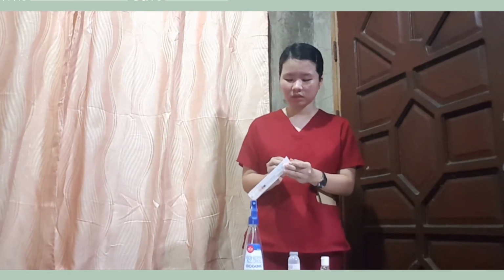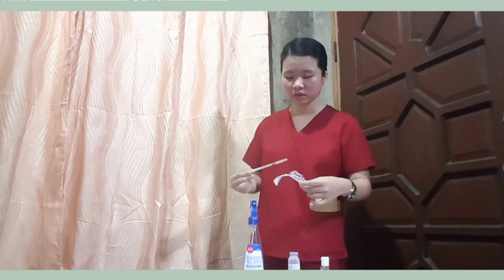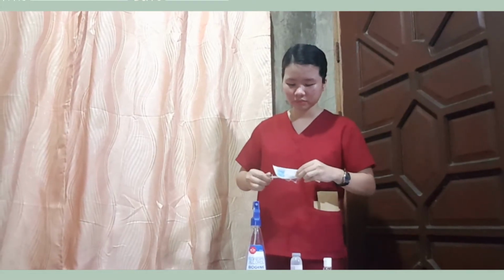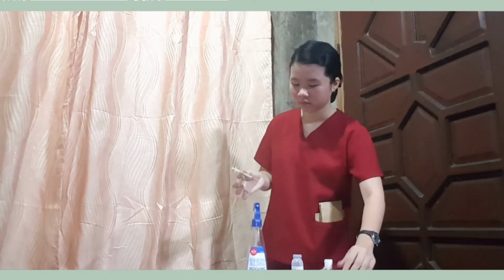Now I'm going to get the new syringe. Only touch here. And we need to put in air, since we're going to put in 1 ml.